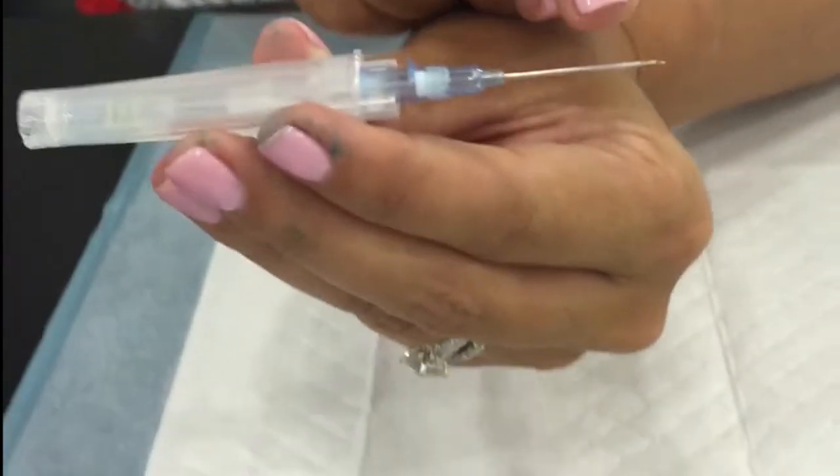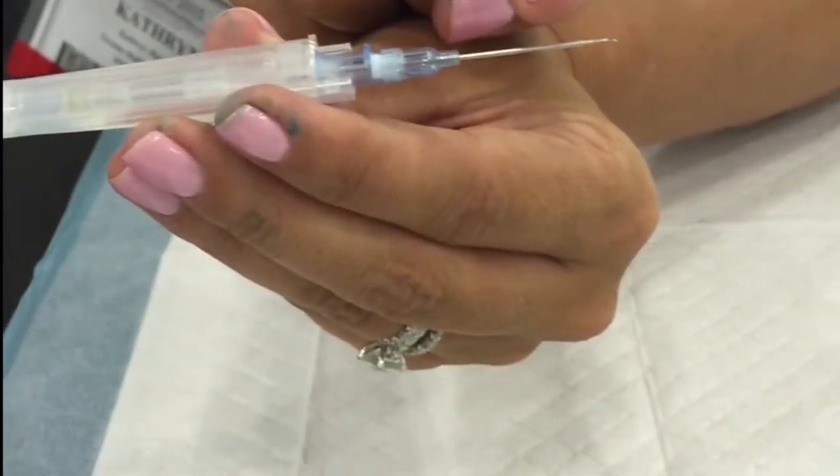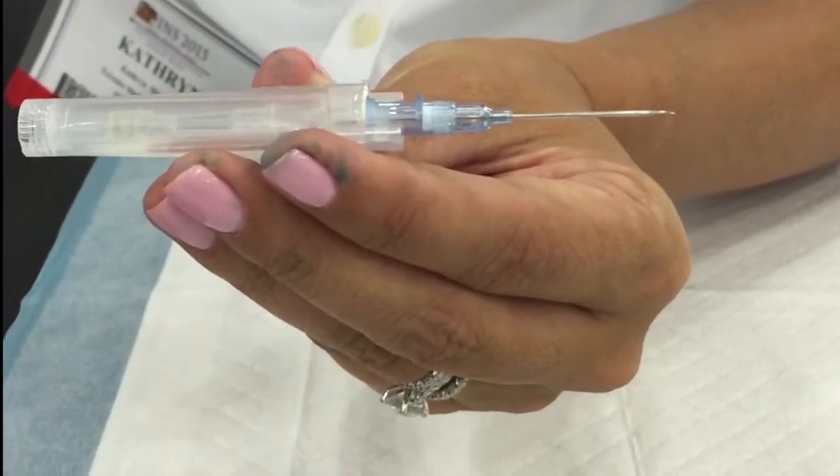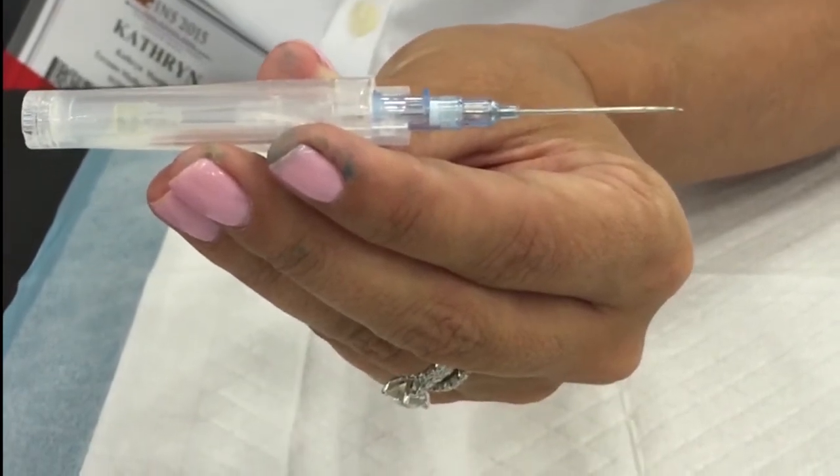They know it's just a demo, you don't have to use clean sterile techniques. As long as you have beautiful hands — I got blue. So with this catheter, it's going — the short flash — when you get the flash in the catheter, it's actually telling you the catheter's in the vein. So you know you can thread off at that point.